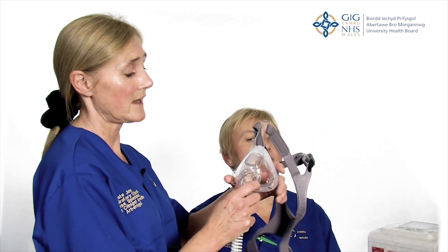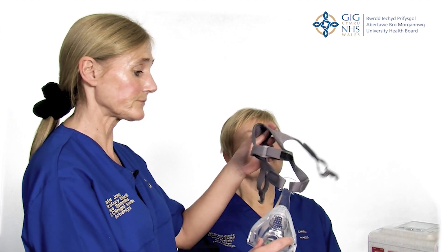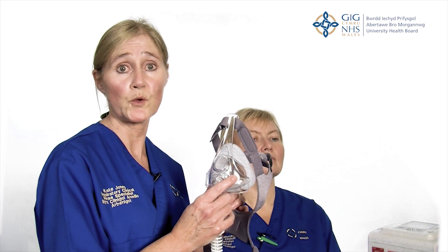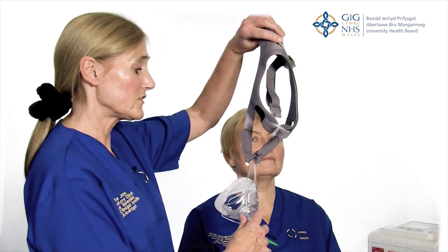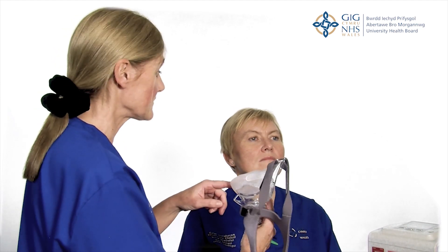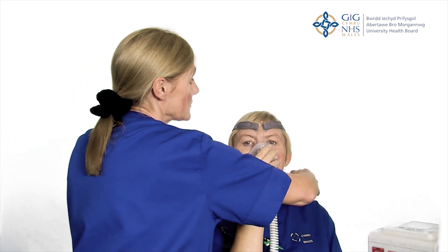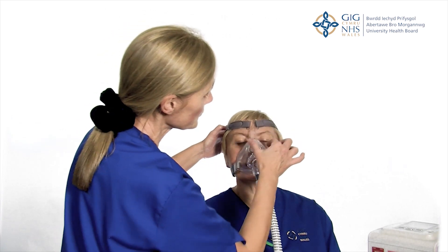So this is the Simplicity mask. As you can see it's got ventilation holes here and that means that Karen's exhaled air will pass through here and leave the circuit. It's got a panel that fits between the eyes and it's very important that this is central because if it encroaches on the patient's view then they will pull at their mask, and the most important thing is that the patient is comfortable and compliant with therapy. Take the straps forward — as you can see it's nice and flexible — and this part of the mask should fit in the groove of Karen's chin. Get the patient to purse their lips and place it gently, just tip it upwards, and get the patient to hold the mask if possible, or get another member of staff. Then put the little clips into the front of the mask and make sure it's central. Is it comfortable? Okay, so we can start therapy.